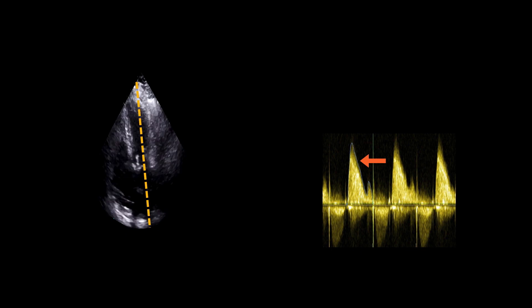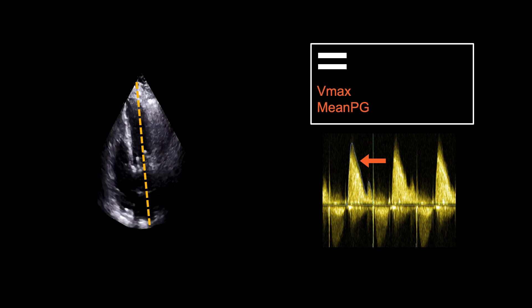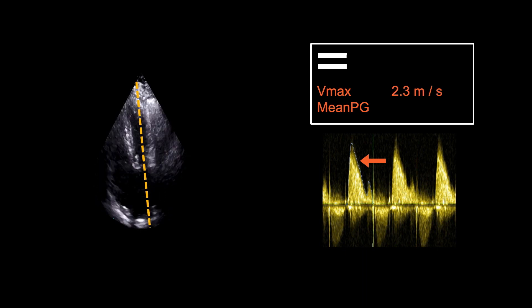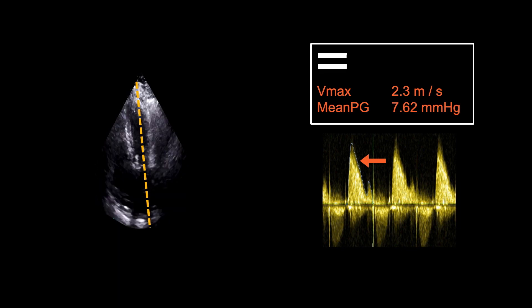Next, trace the Doppler profile to determine the peak velocity and mean pressure gradient. Here, the peak velocity is 2.3 m per second and the mean pressure gradient is 7.62 mmHg.